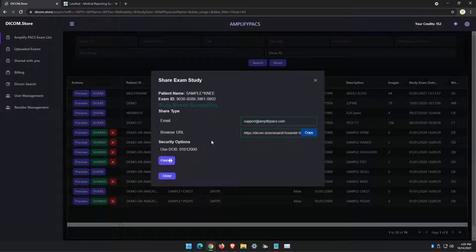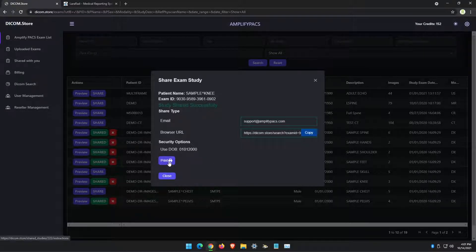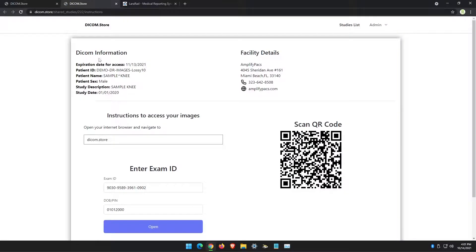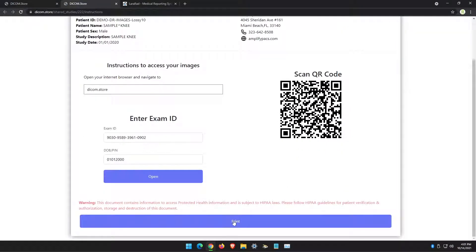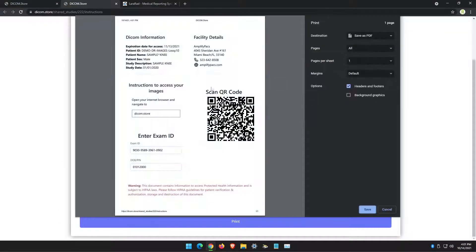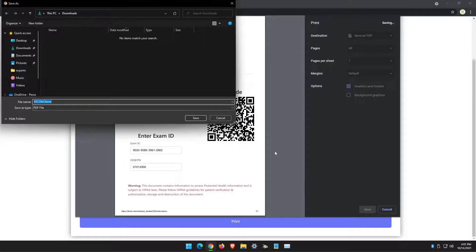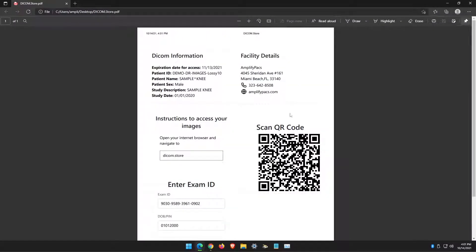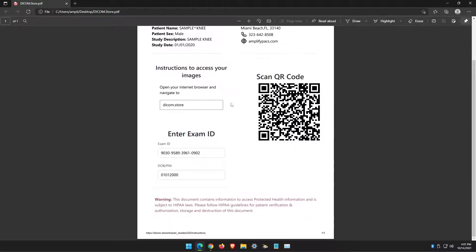If the patient is on site and you want to print out a document that you can hand to them, just use the print option. It will create a document that you will send to your printer. I'm going to save it as a PDF, just so that you can see what it looks like.